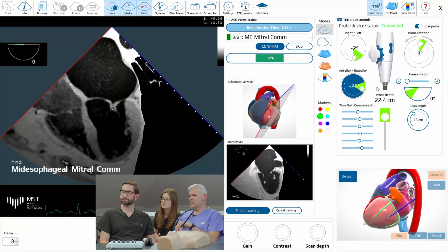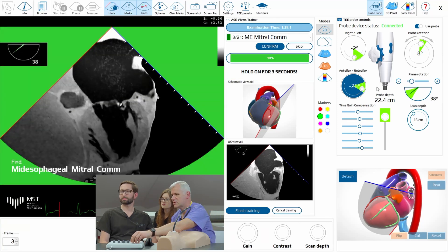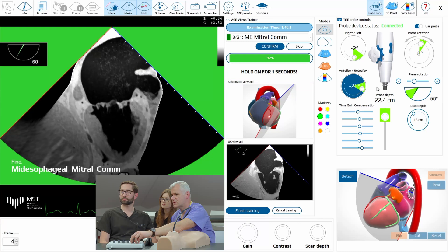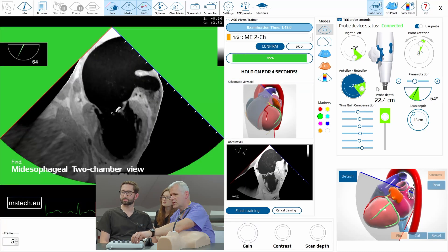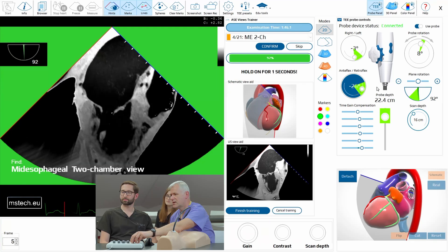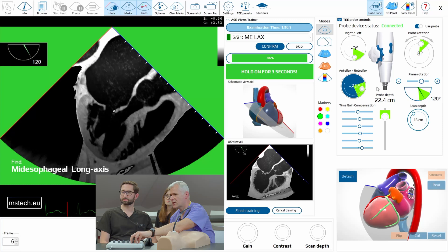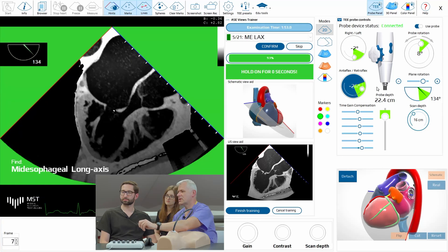The next one will be the mitral intercommissural. I'll keep this view and rotate the plane to 60 degrees and you'll see the intercommissural. Then two-chamber view at 90 degrees — and it's good. Now mid-esophageal long axis view of the mitral valve, and so on and so on.